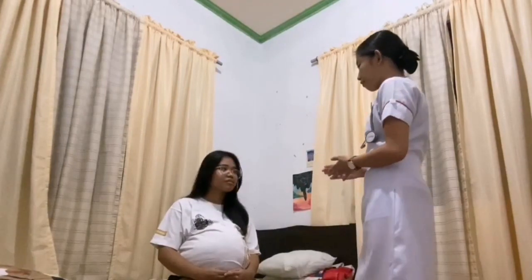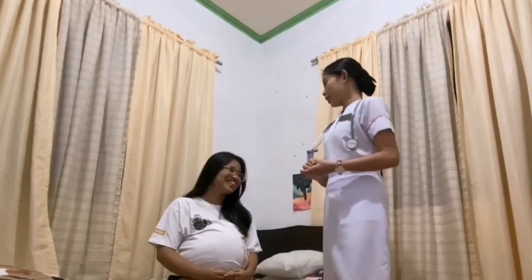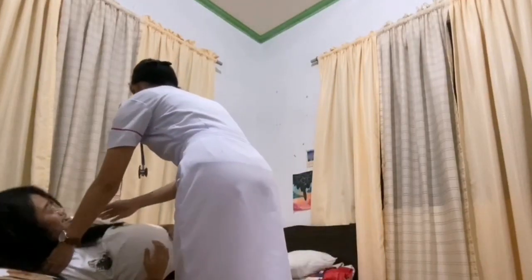The next thing is to let the patient empty her bladder prior to the procedure. So ma'am, would you like to use the comfort room first? No, thanks. Okay. Position the patient on supine with one pillow under her head and with knees slightly flexed. This is to facilitate accurate assessment, provide comfort, and relieve tension of the abdominal musculature. So ma'am, you can lay down now.